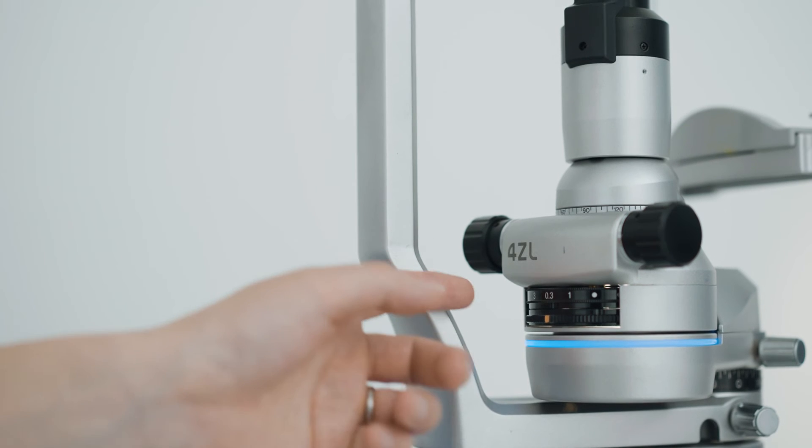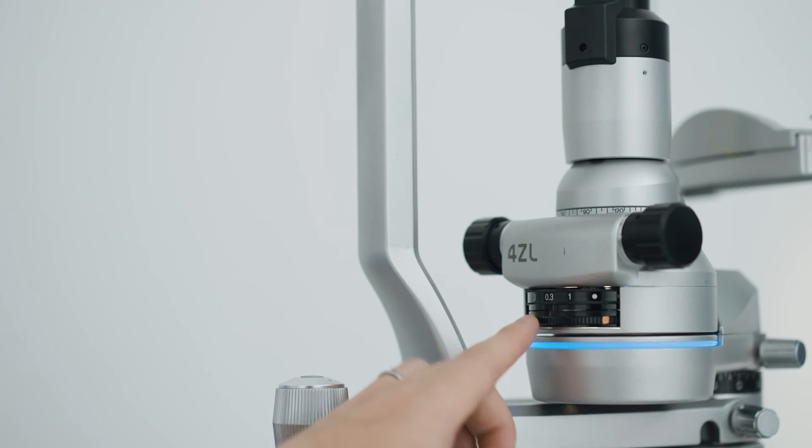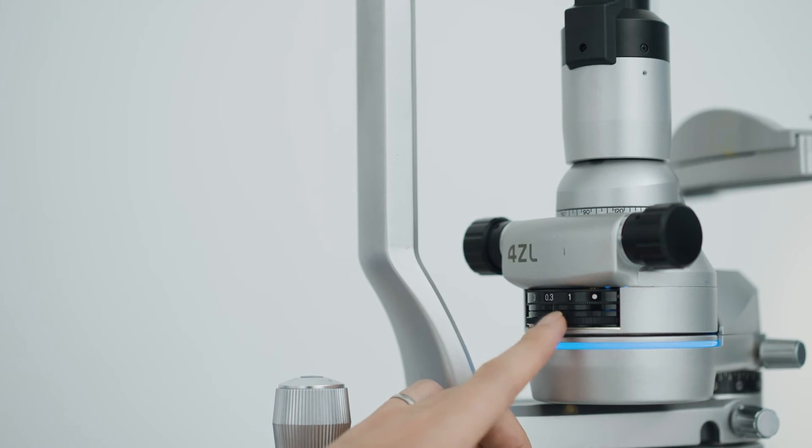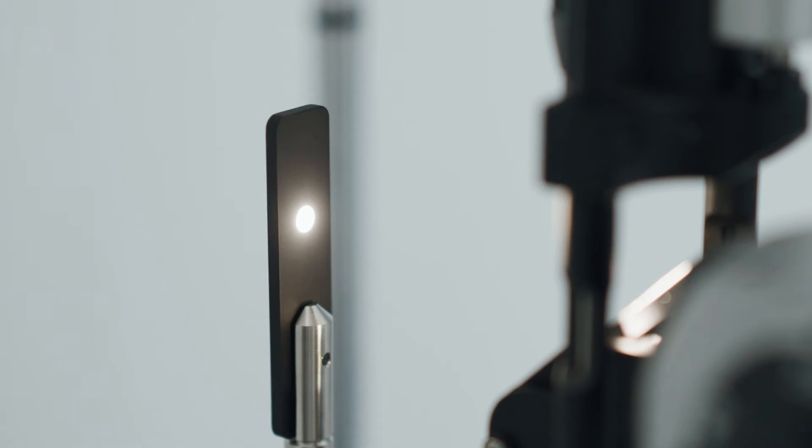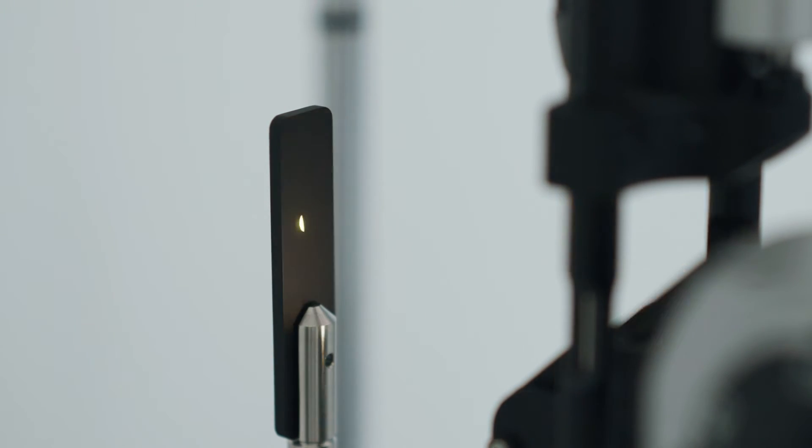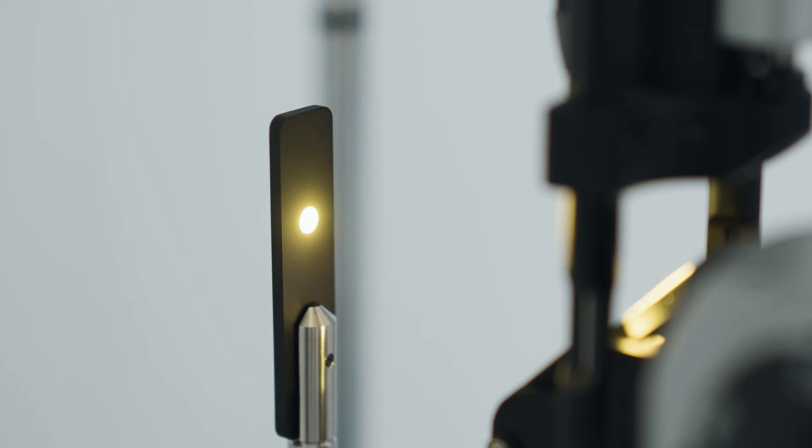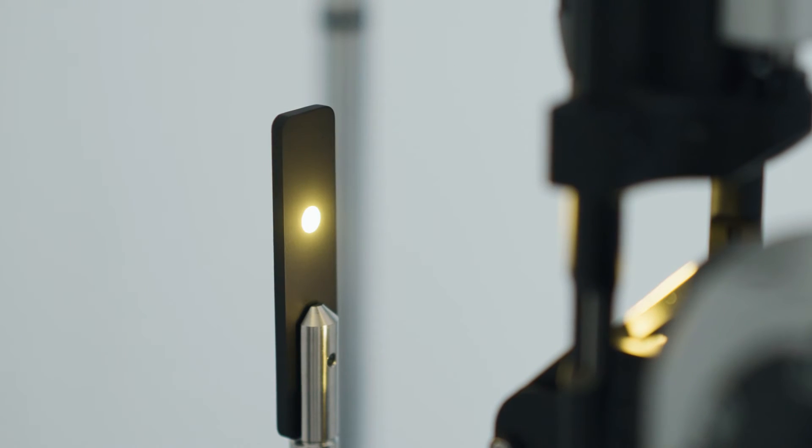Takagi's slit lamps come with a wide range of filters as standard. The blue correction filter is Takagi's original protective filter producing a color tone similar to that of a halogen lamp while preventing harmful light damage.